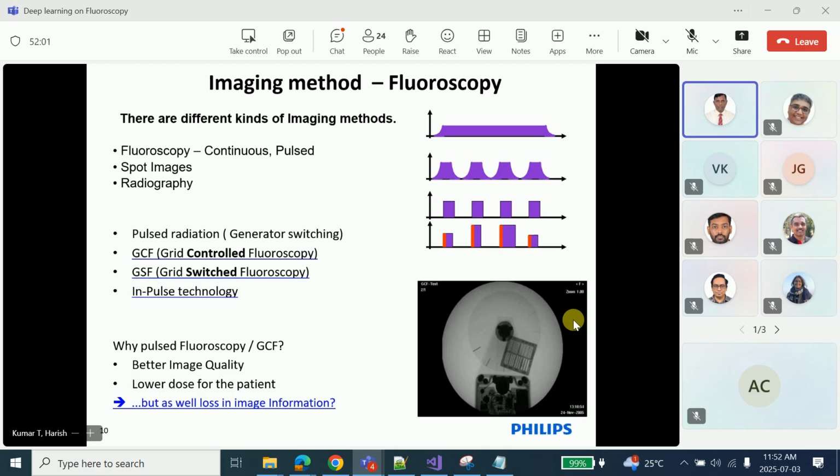See, for example, when conventional fluoroscopy initially came, how were we looking? We were looking at a fluorescent image. See, all these innovations, where we brought real-time images at 30 frames per second up to 60 frames, these all came from R&D innovation.